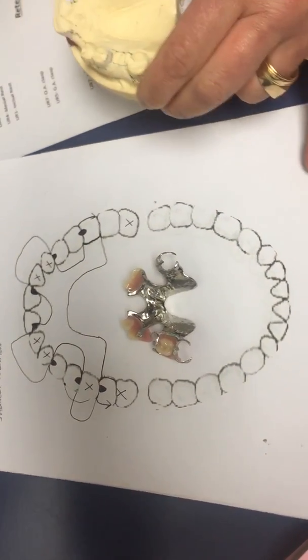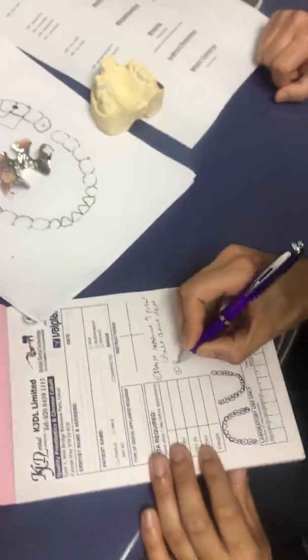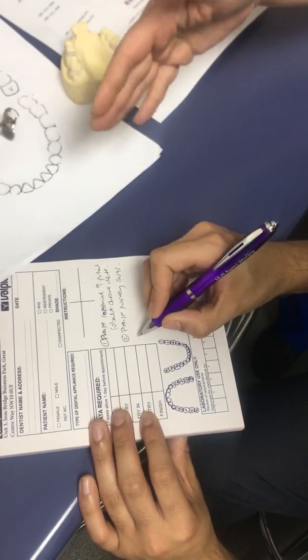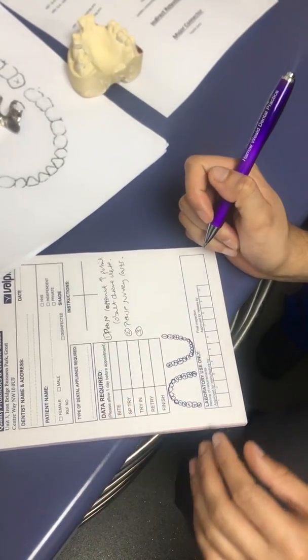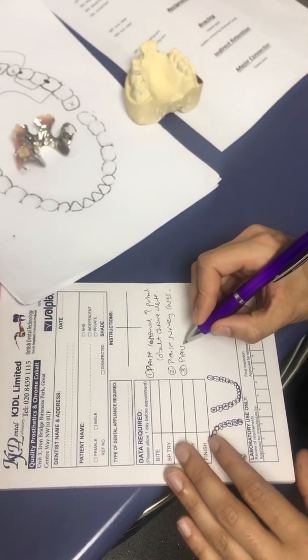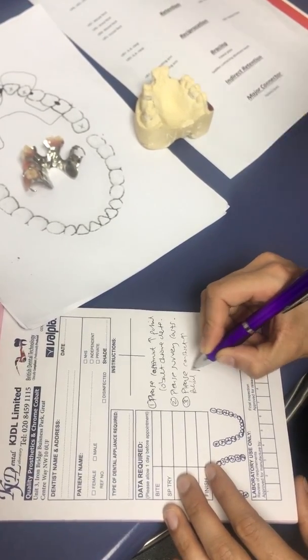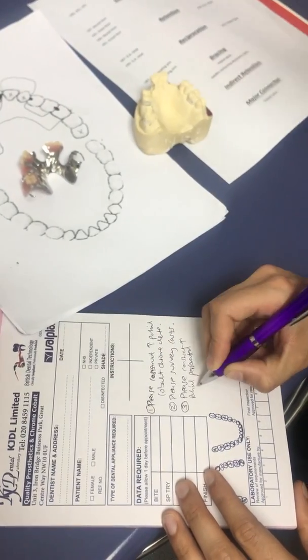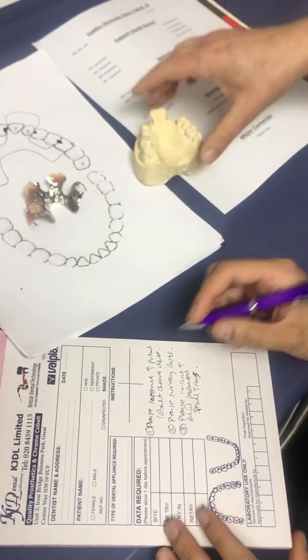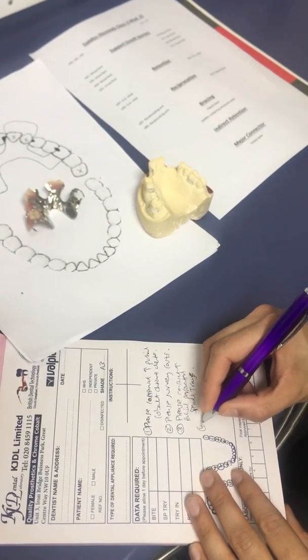Now he's doing his lab sheet as well, and the lab sheet will be quite clearly written. He's going to write about his cobalt chrome framework because he wants to do a try-in for the framework first before he does a jaw registration. So he's writing all the instructions quite clearly. Obviously you won't forget to put your name, address and everything. You won't forget to disinfect impressions.